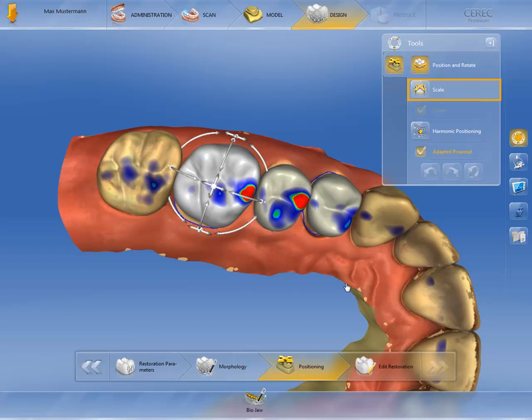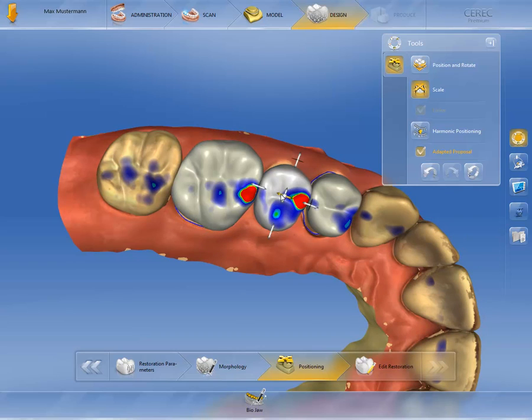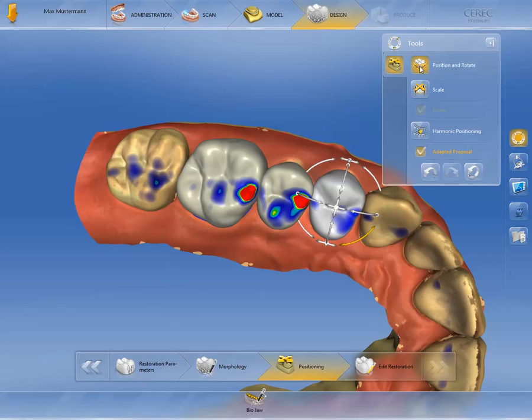See here how the restoration can be scaled by using the arrows. We are now changing to the Position and Rotate tool, and we rotate the restoration by again using the arrows.